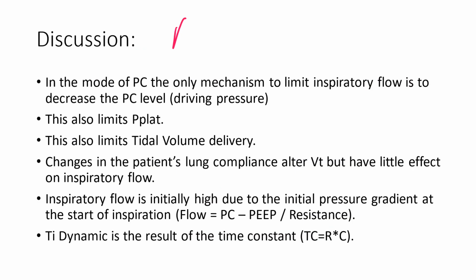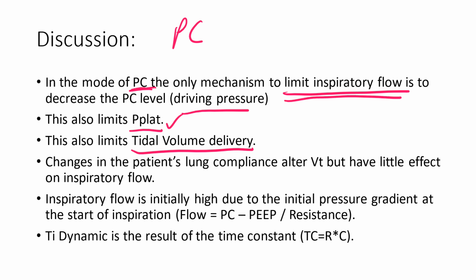So in the mode of pressure control, it's important for us to demonstrate and to realize that the pressure control level is the only mechanism we have to limit the inspiratory flow. All right, so the pressure control level, which is the driving pressure, is our mechanism to decrease both tidal volumes and inspiratory flows. Yes, it limits the P plats, which is an important consideration because we don't want to have overdistension. Yes, it controls our tidal volume delivery. So all of those components are important to realize, but I wanted to make the association with the inspiratory flows.